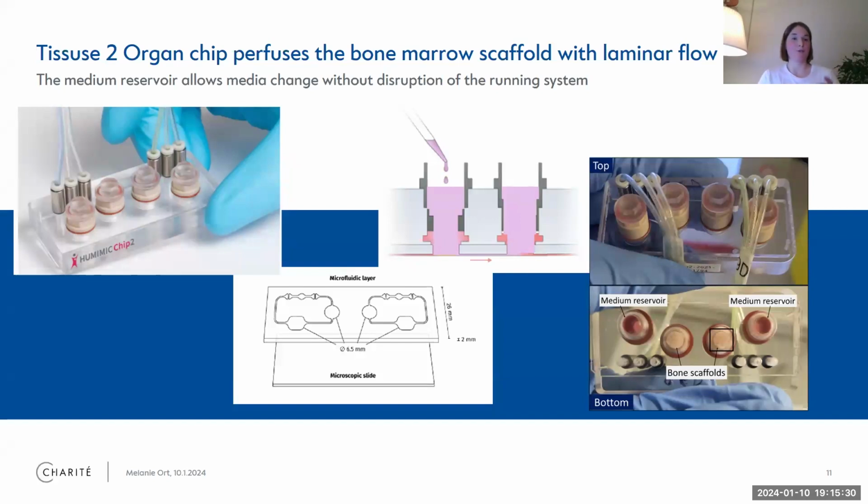That's pretty cool, because you can just unscrew one lid and do a media change without disrupting the bone that is in the other chamber.